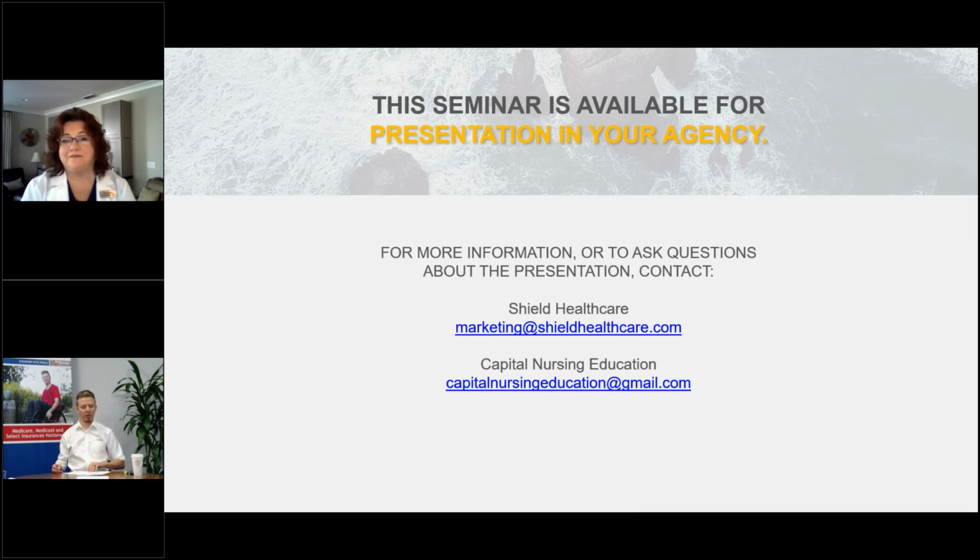So that concludes the webinar today, but I would like to open it up for question and answers. We have a first question here from Amanda Kelly. Is the intermittent cath a one-time use, or do you use a new one each time? That depends on the patient and what they're using it for. Sometimes, like I said, patients in the home, if they're using intermittent cath often, will wash them, allow them to air dry, and use them again. But if they're active people and they're out and about, then they're going to probably use the closed system, and that's a one-time use.